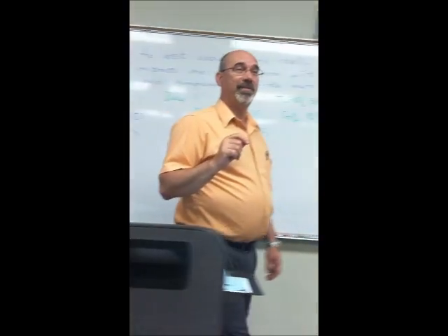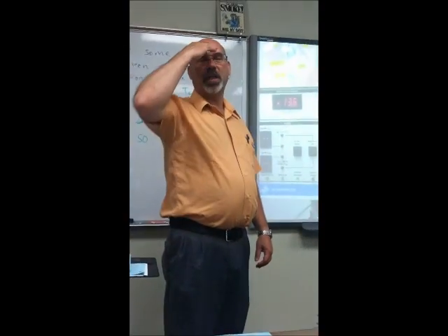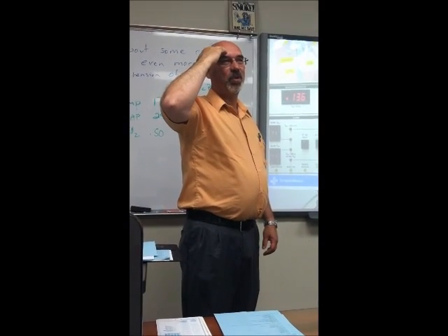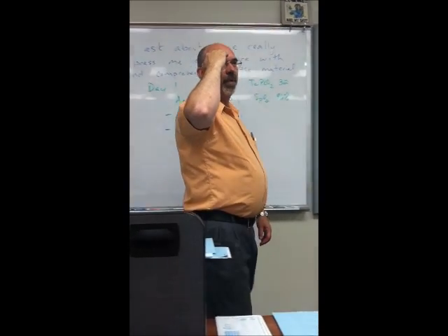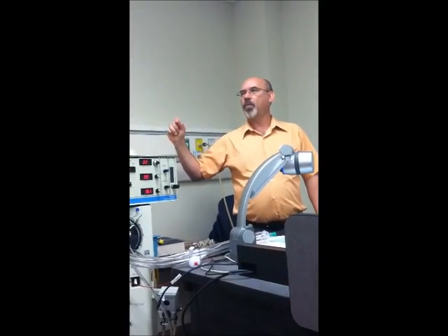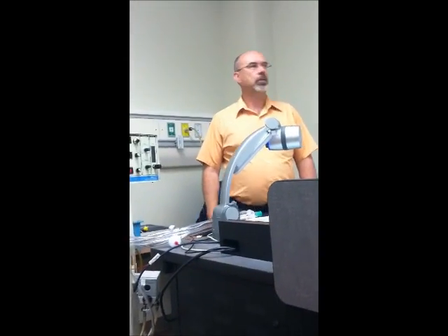You probably know that if I get orders over the phone, I typically write it down. Because you don't want to get back to the ventilator and say, did they say an amplitude of 22 or did they say an amplitude of 20? If you get them from the chart, often the chart won't be in the room, so if you read it off the chart, you might want to write it down on a piece of paper too. Over the phone, I would definitely try to do it.